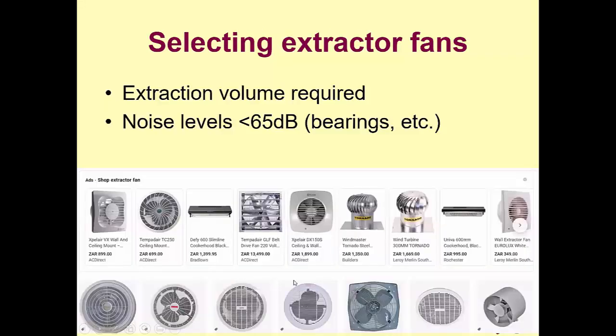Now, when you select your extractor fans, you can just go on Google and you can see some of these are very cheap. There's one for 350 Rand that you can put in the typical bathroom sort of thing. Don't just fall for all these things. Make sure that you get the specifications for these things.